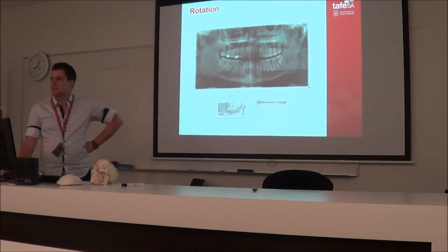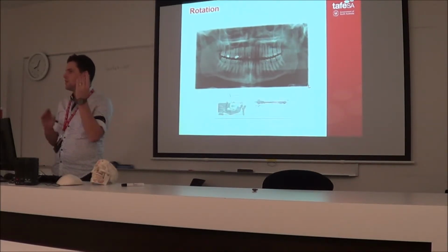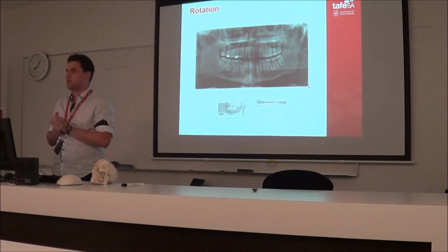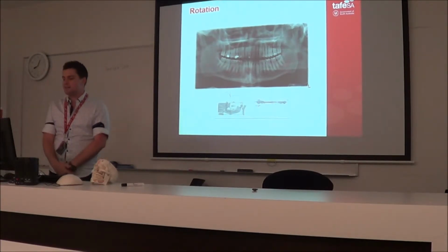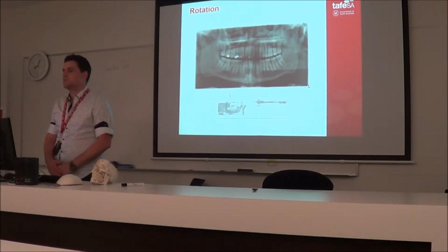The left side. So the left side is too close to the sensor, so the object film distance decreases, and then we can get a variation. Vice versa, if we have the object film distance increasing on the opposing side, it's going to get a lot wider. So if this patient had their left side being really, really close to the sensor, what does that mean? How would their head be turned?